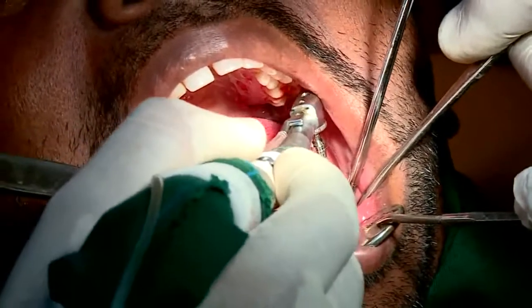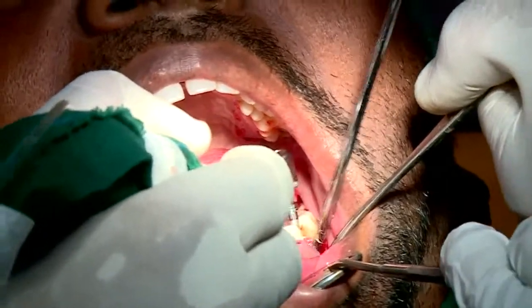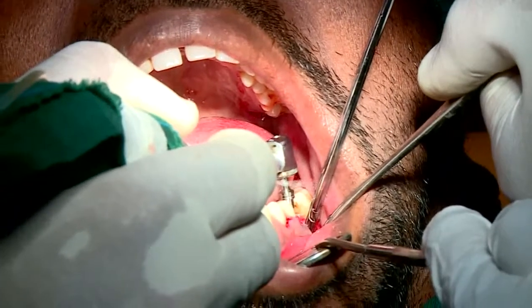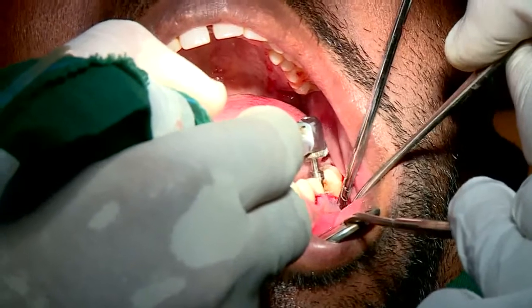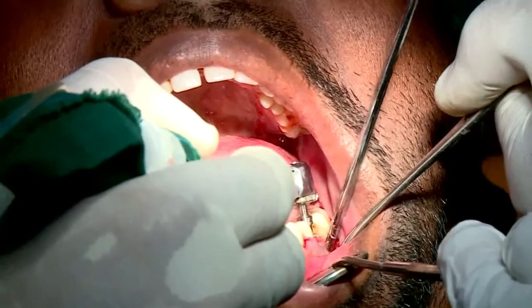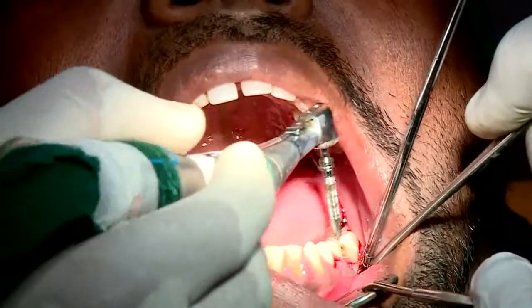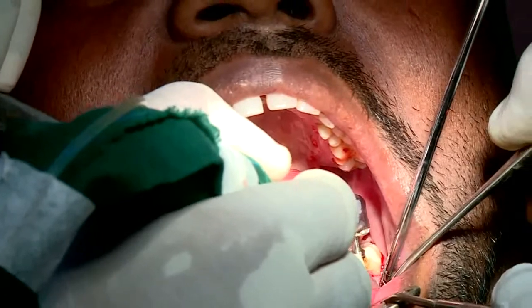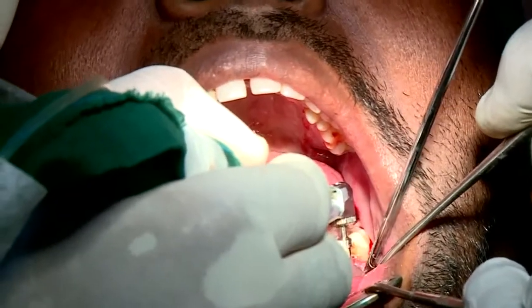From natural sources, suppose you have a 3 molar. They have planned 3.75 into 11.5. 3.75 is the diameter and 11.5 is the length of the implant. The basic guideline will tell you that to place the implant, the minimum distance between the natural tooth and the implant will be around 1.5 to 2 mm. Not closer than that.